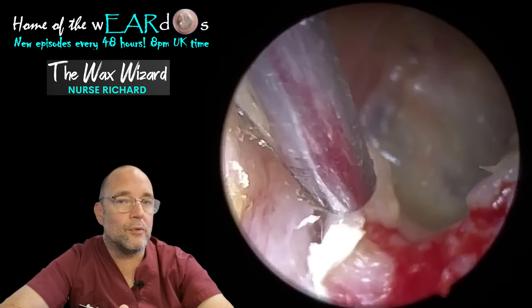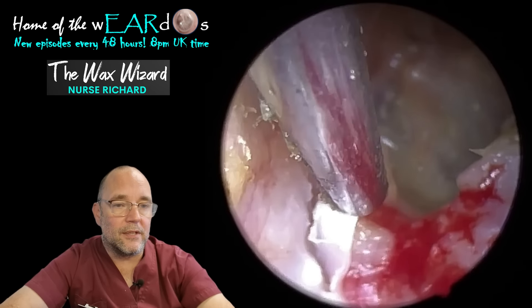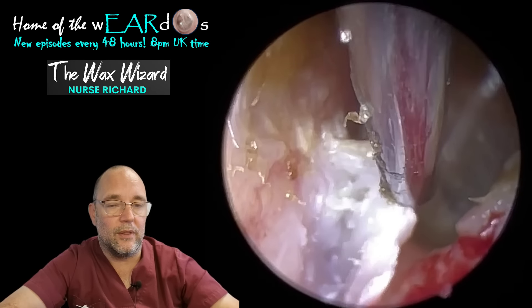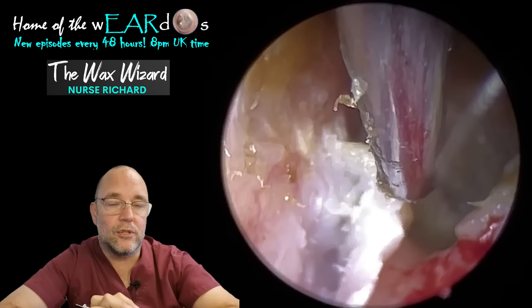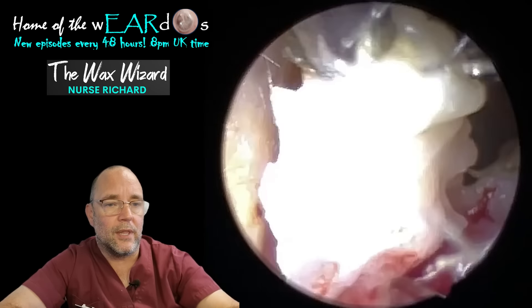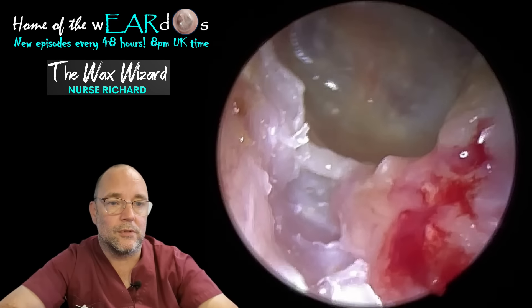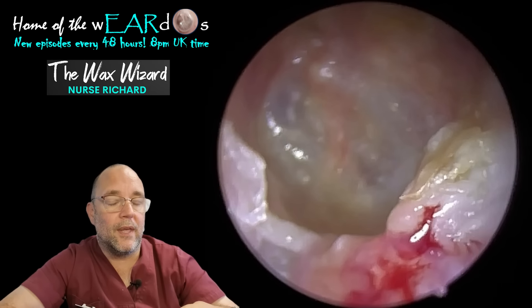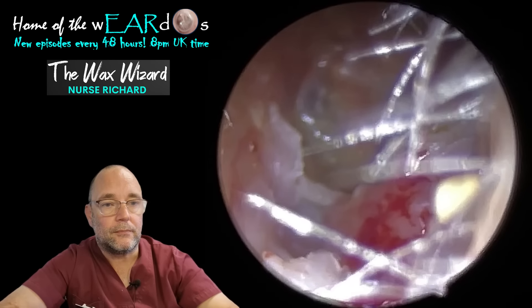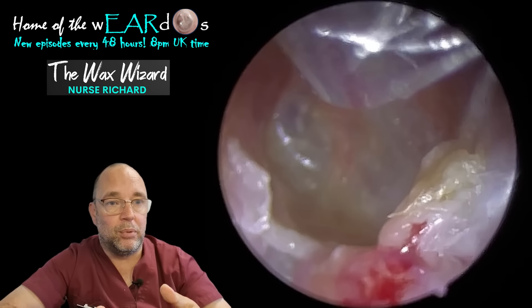But I still want to reveal the true extent of what is going on here. Could be one of two or three things. I'm going to use an analogy here because these conditions can be described really well as a top-down one or a bottom-up one. A bottom-up one is where there's an issue on the floor of the ear canal with the circulation, the blood vessels. Now, if someone's got a condition that compromises them in any way - diabetes is a very common one, or any condition that restricts the blood flow - when the blood flow is restricted, especially in the peripheral ones, the smallest ones, capillaries and what have you - if there's not enough blood getting there, there's not enough oxygen. If tissues don't get enough oxygen, they die, basically. That's the long and short of it. So that's what happens from the bottom-up.